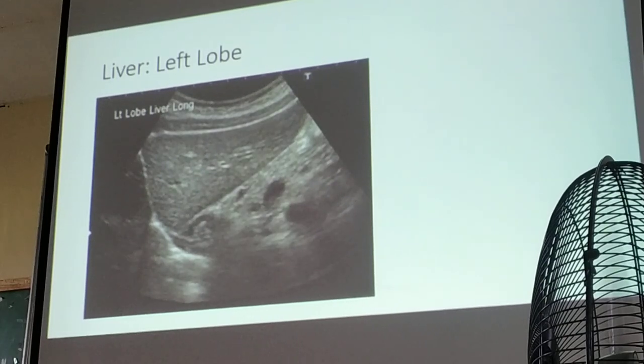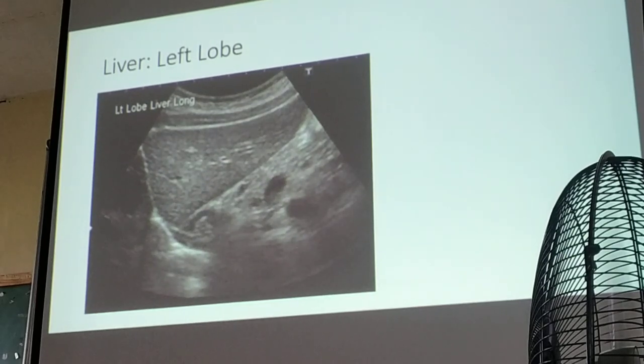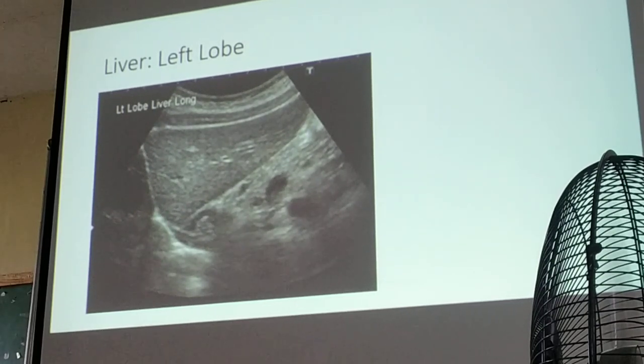Have you encountered that? Have you been to the ER? Some residents would ask for a FAST ultrasound just to determine the presence of fluid in the vital organs of your victim. Okay? So, all we do is look for the presence of fluid in doing the FAST ultrasound.